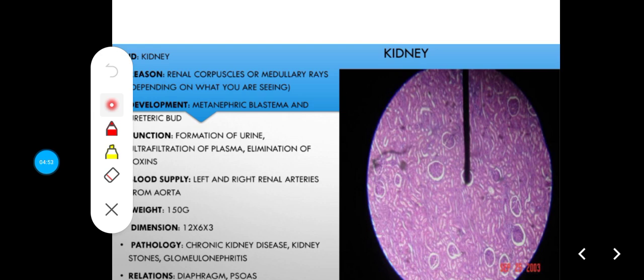While in the distal convoluted tubules, the lumen is majorly clear and the cells lining them are simple cuboidal epithelium, but no brush border. Hence, the lumen is a bit clearer and more distinct than in the proximal convoluted tubules. Then the medulla contains more of the loop of Henle and the collecting duct, and they also stain poorly. They don't stain as much as the proximal convoluted tubules.